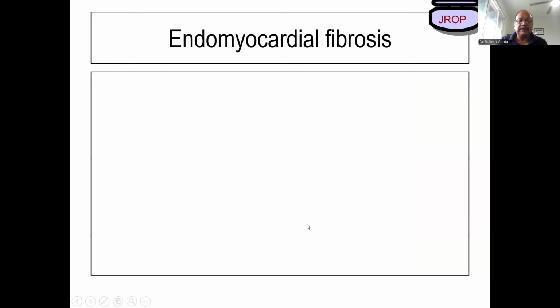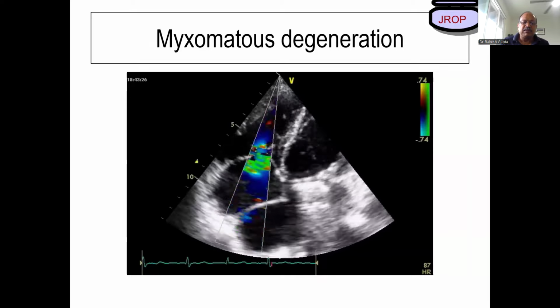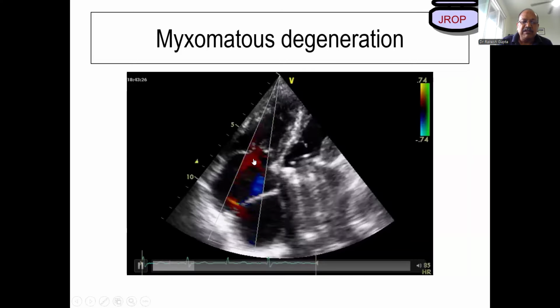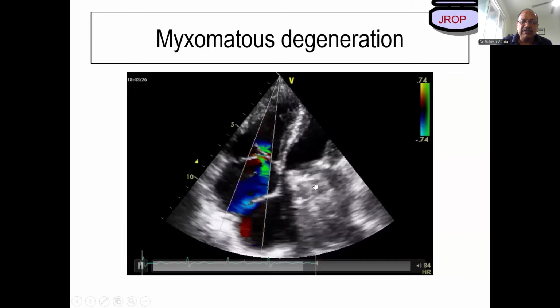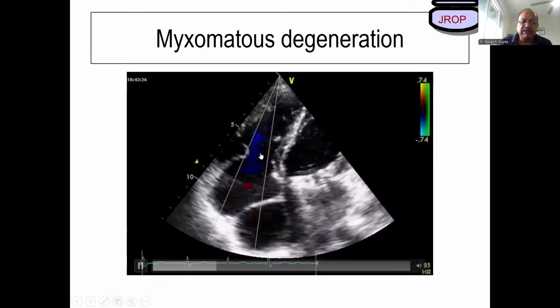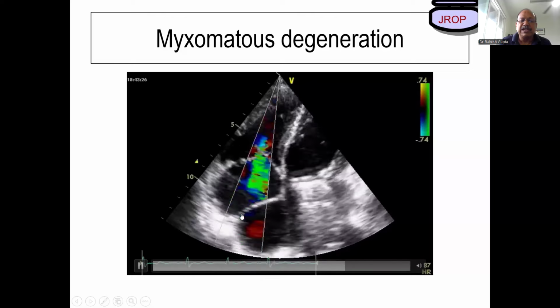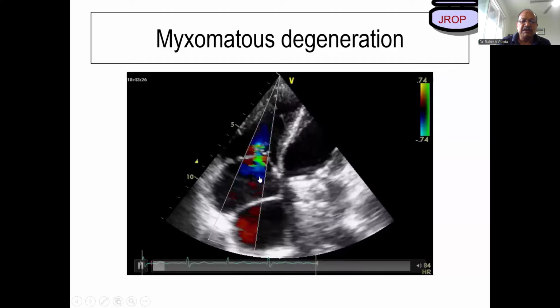Endomyocardial fibrosis is another condition. And this is very classical. I could pick out this picture from one of my armamentarium. Look at this myxomatous tricuspid valve leaflet. This patient had a replacement of aortic as well as mitral valve leaflet. And somehow this tricuspid valve leaflet, which is myxomatous along with cor triatriatum dexter, was left behind during surgery, and again producing a significant tricuspid regurgitation.